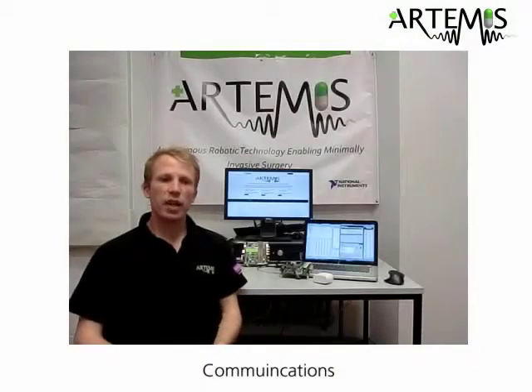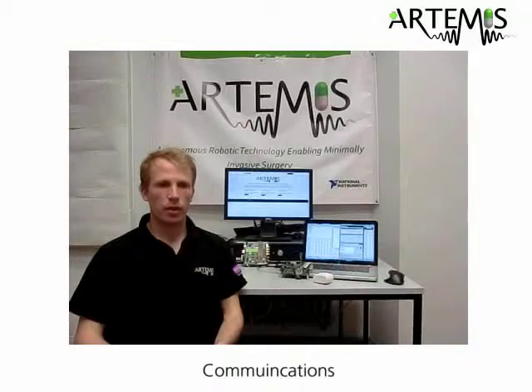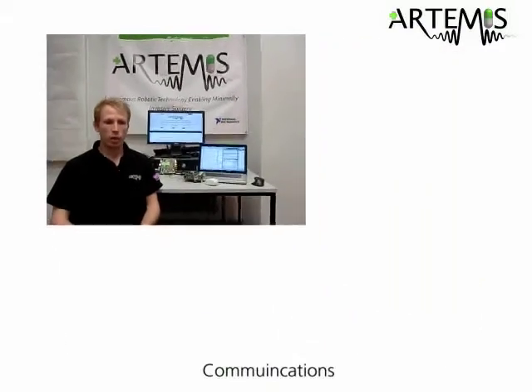To provide communication capabilities in the scaled capsule, it was necessary to develop an embedded wireless communication system. The most important component was the transceiver chip, which had to be very low power for our application. The best suitable transceiver was found to be the CC1101 from Texas Instruments. It is a low-power wireless transceiver that can operate at 433 MHz and offers the flexibility to configure modulation scheme and output power in software.